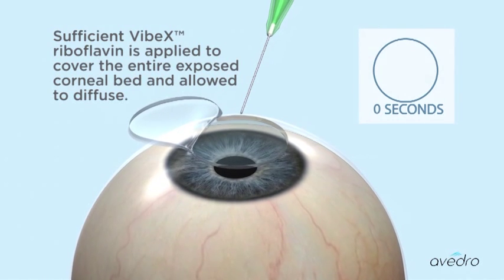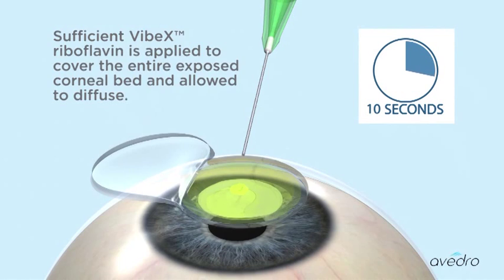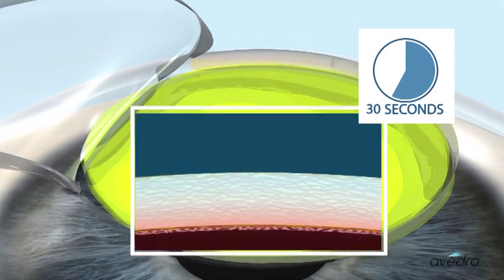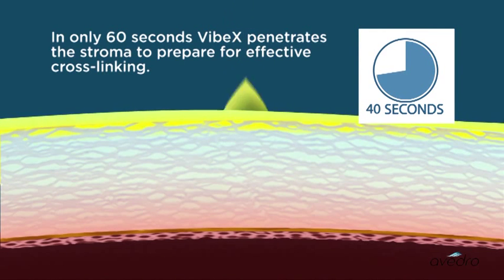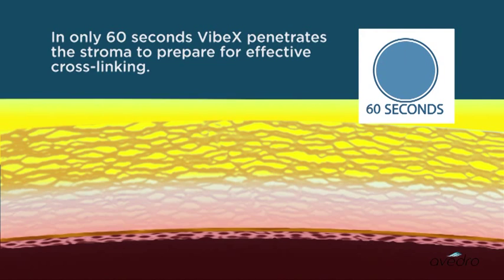Sufficient Vibex riboflavin is applied to cover the entire exposed corneal bed and allowed to diffuse. In only 60 seconds, Vibex penetrates the stroma to prepare for effective cross-linking.